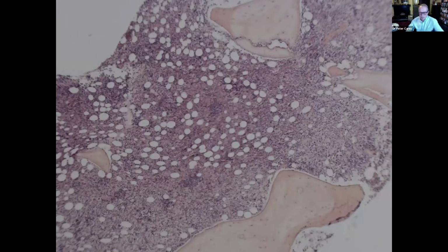Now, I know with this audience trephine material is perhaps unfamiliar, but we're going to come on to aspirate material and peripheral blood material shortly. But we've got a nice bone marrow core here. It's rather hypercellular for a 72-year-old lady. There should be slightly more than 50% of the space occupied by fat in these globules here. And so we can see that there's a lot of cells.